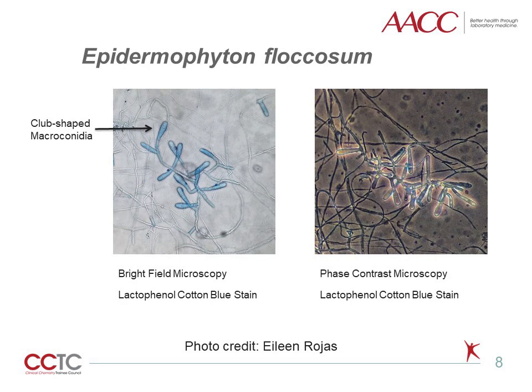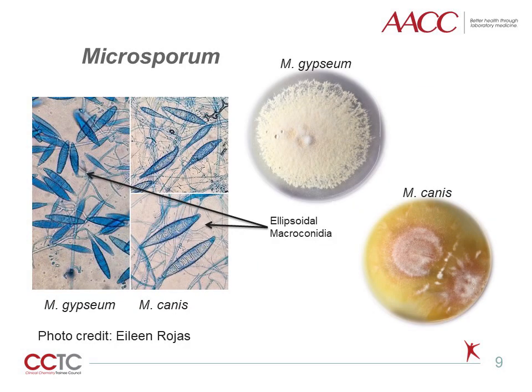All lactophenol cotton blue stained images in this presentation were taken by Eileen Rojas. While there are more members of the Microsporum genus than the two shown here, Microsporum gypseum and Microsporum canis are good examples to demonstrate differences in the conidia.